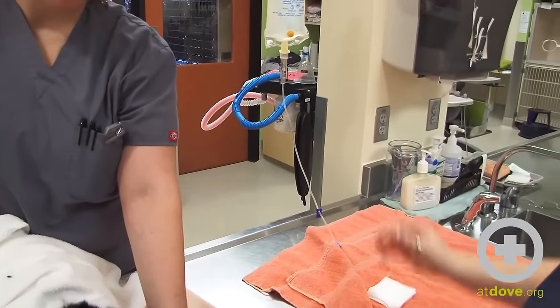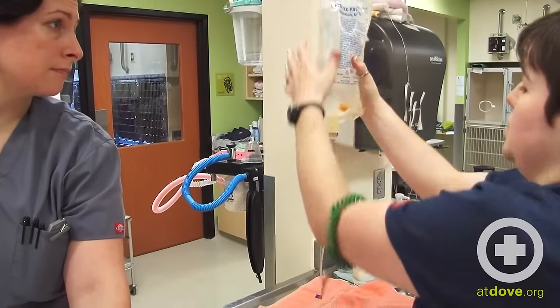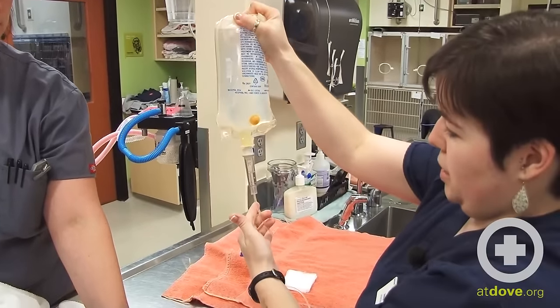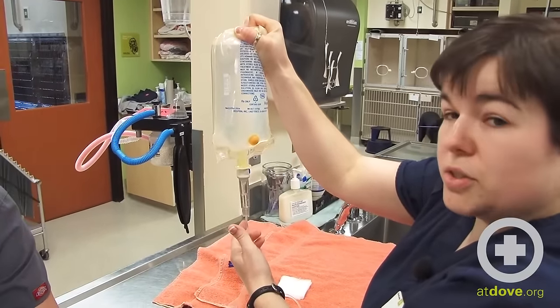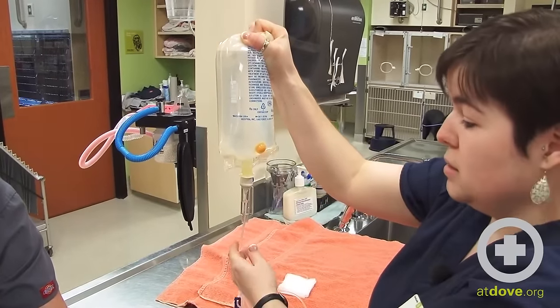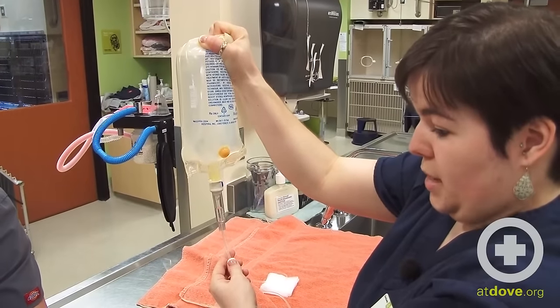It's also acceptable to put pressure on the fluids — just give the bag a little bit of a squeeze and you can see the fluid goes through faster. Some animals get anxious at this; it feels cold and they can feel their skin stretching out and don't tolerate it as well, but this kitty is doing pretty well with the fluids going pretty fast.